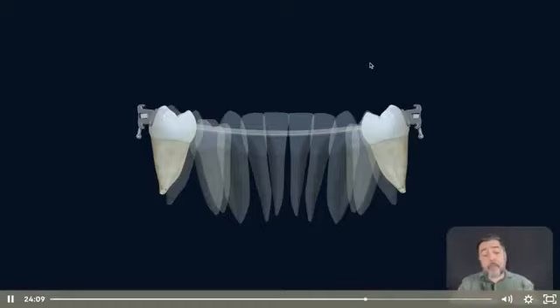Why is that? Because the inclination of those teeth is good, and because we have a pre-programmed bracket, the tube now has the slot parallel to the horizontal line. And the horizontal line in the neutral torque is parallel to the cross-section of the wire. So it will match the inclination of the wire, and will find the exact inclination of the posterior teeth slots.